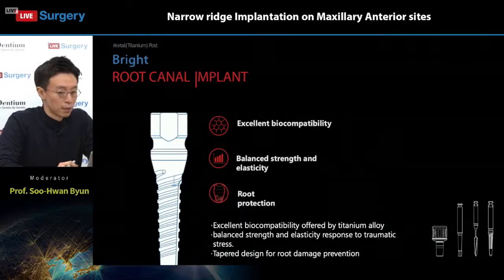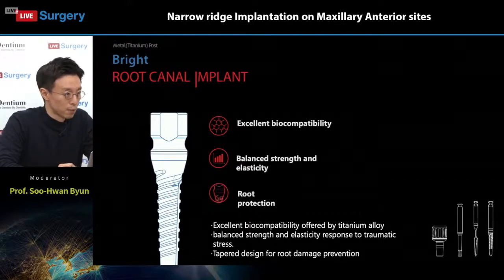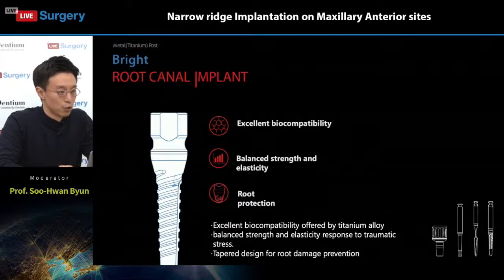The root canal implant is made with titanium alloy, which provides excellent biocompatibility and balanced strength. It has an elastic response to traumatic stress. The taper design prevents root damage.